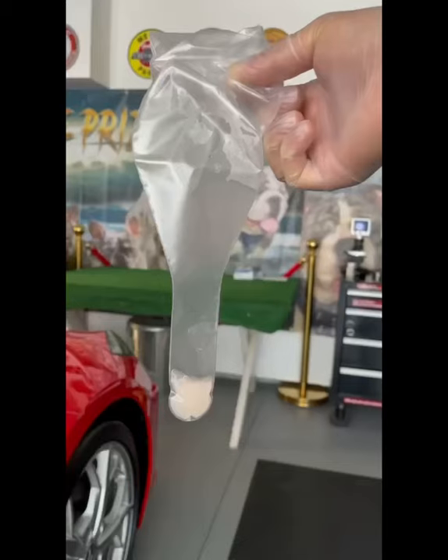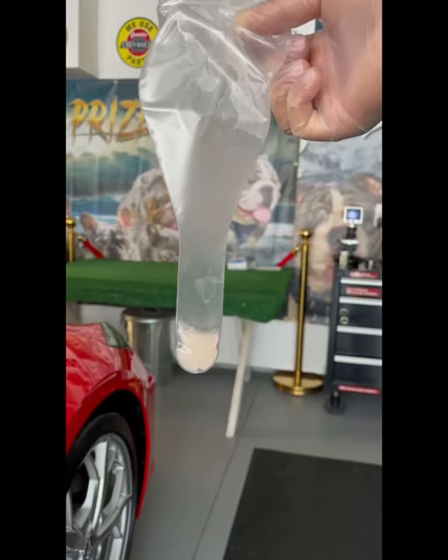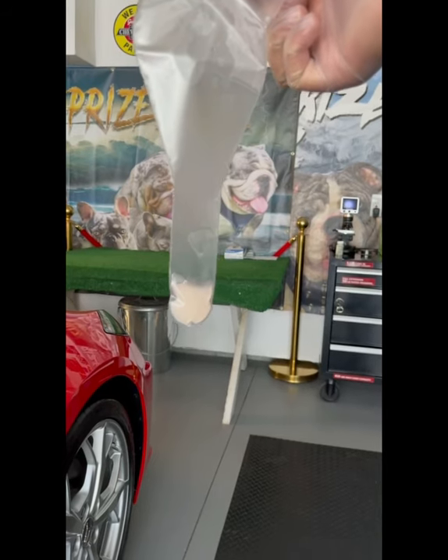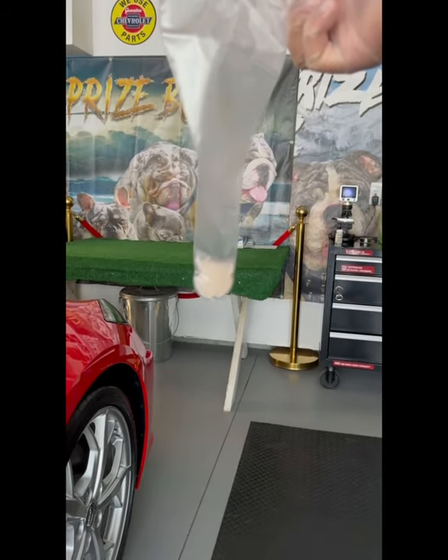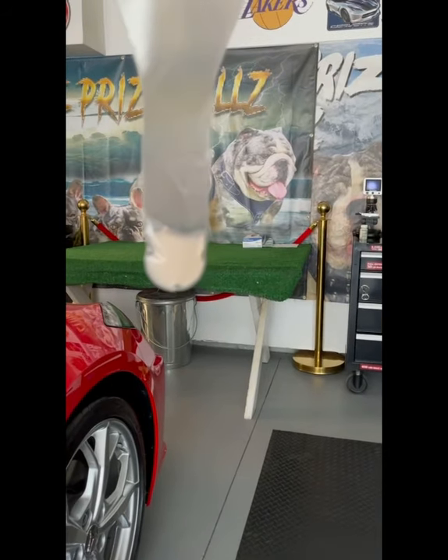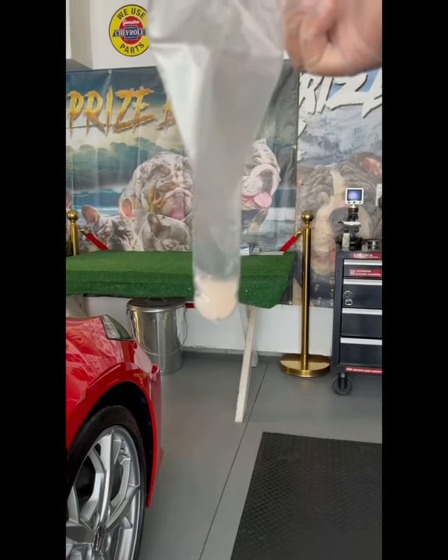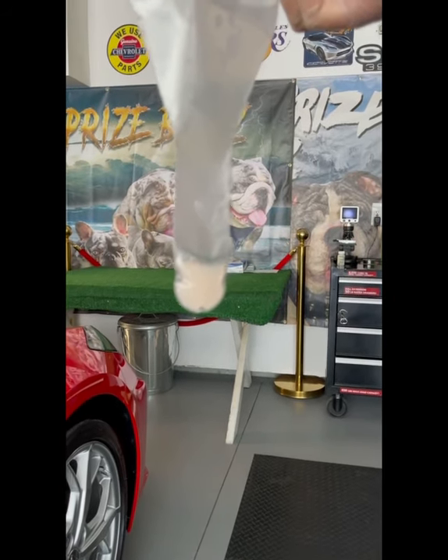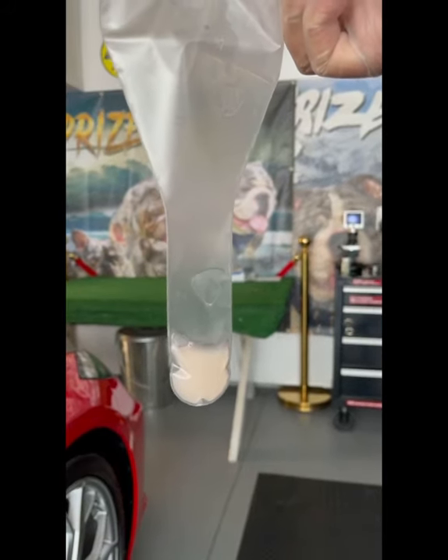Collection is done. Semen looks awesome — looks white, milky, rich. That's the way it's supposed to look. I see a lot of people collecting their dogs and their dogs shoot 5 or 10 cc's of very watery looking semen. That's not what you want to see. This is what you want to see: A1 semen.